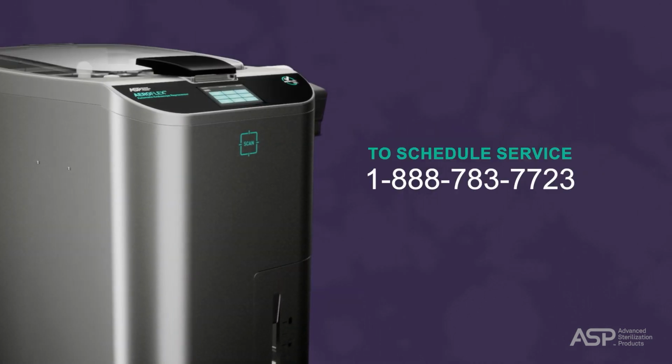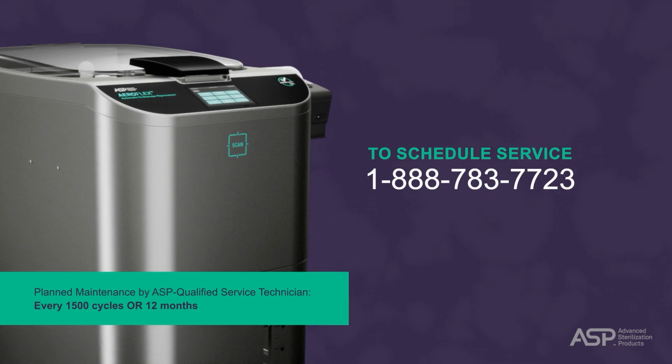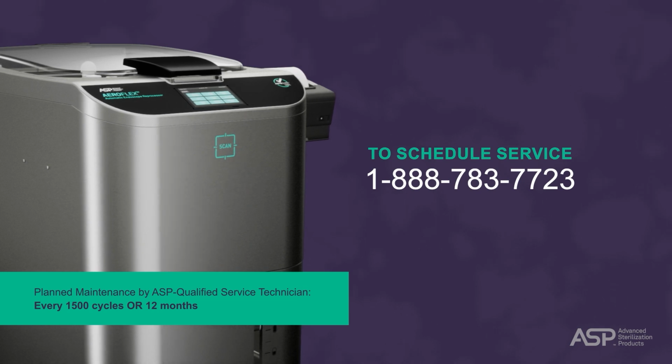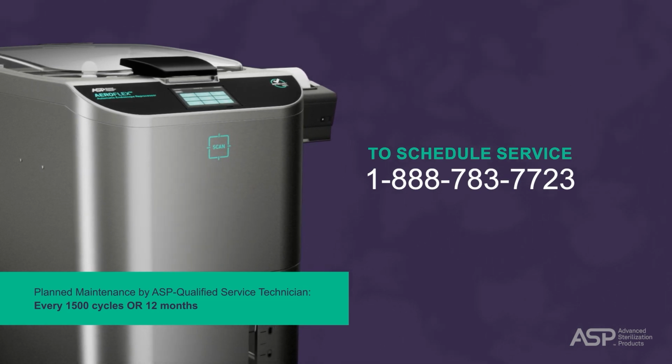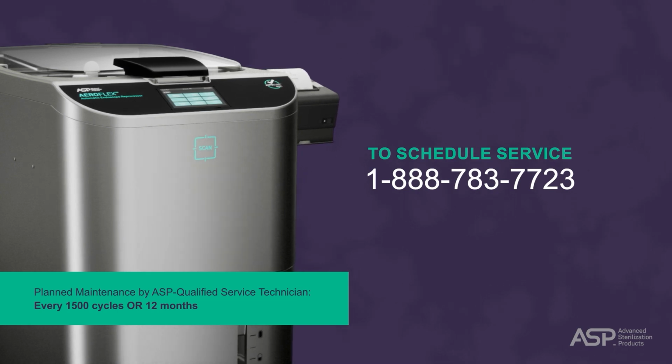Planned maintenance by an ASP qualified service technician is required every 1,500 cycles or 12 months, whichever comes first. The system will notify you on your cycle printout when 50 cycles remain. Contact your ASP service representative to schedule service.